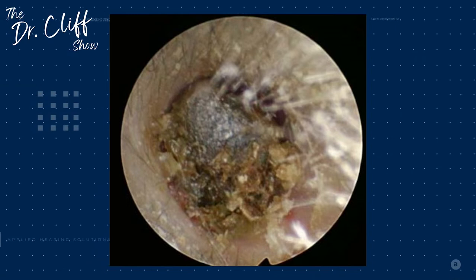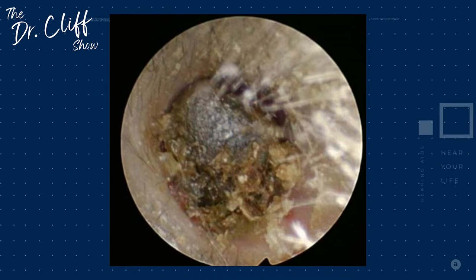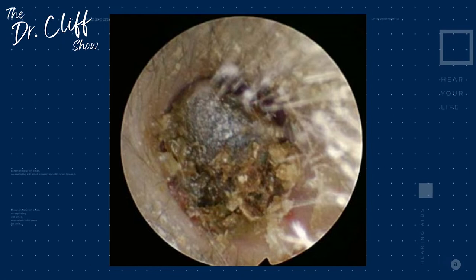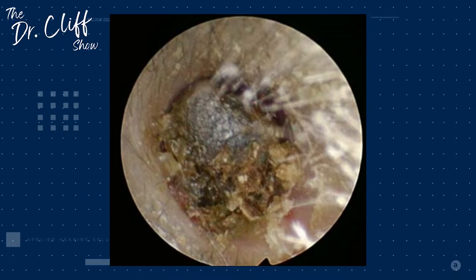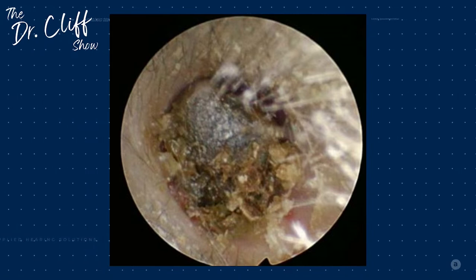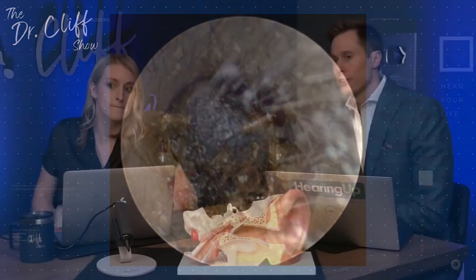However, some people produce much more earwax than other individuals, and it starts to kind of pile up on itself. And then we end up in a situation like you see on the screen, where that earwax over time has just piled up to the point now where it is completely impacted. And when we say impacted, it means that it is blocking the entire ear canal and we cannot visualize the eardrum. And that is acting just like an earplug. Absolutely. You get a 30 decibel flat hearing loss with that. When I say flat hearing loss, I mean low, mid, and high frequencies. Literally like someone put an earplug inside of your ears.